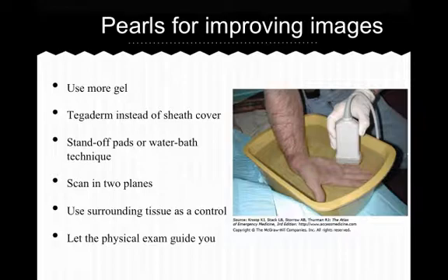For that reason, water conducting ultrasound well, a water bath technique is also an effective way to eliminate artifact. This involves placing the limb of interest in a tub of water and scanning with the probe just below the surface. An added benefit of using the water bath is that the probe doesn't actually have to be in direct contact with the tender injured area on the patient.